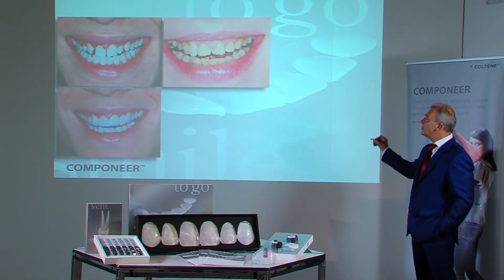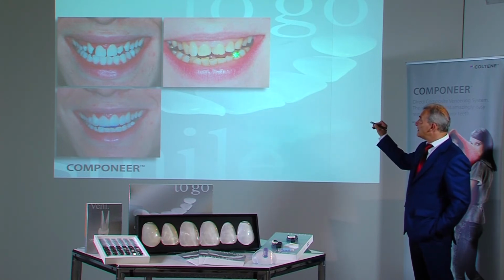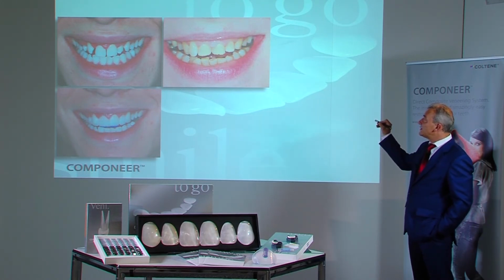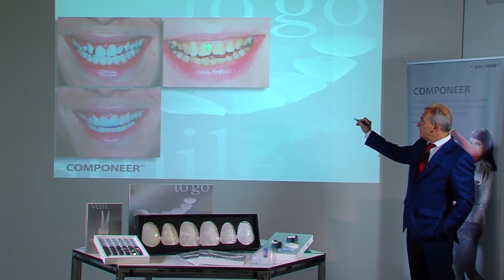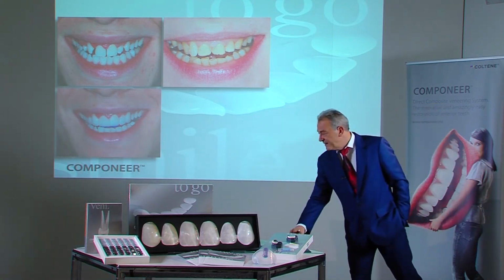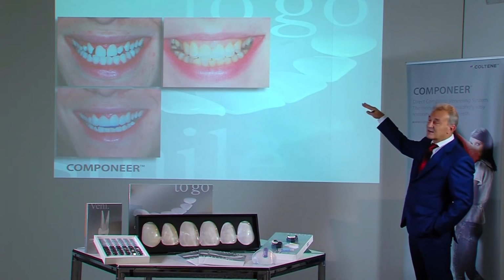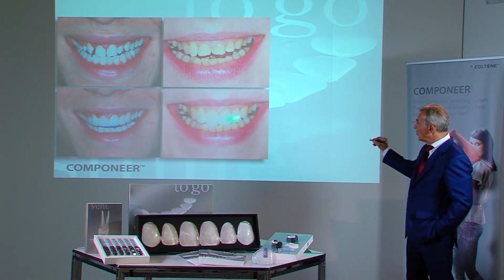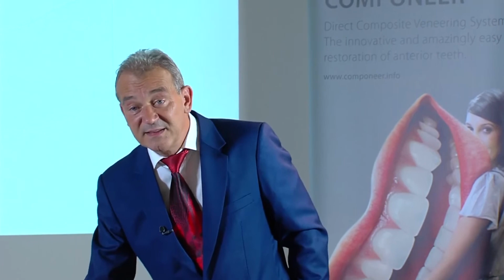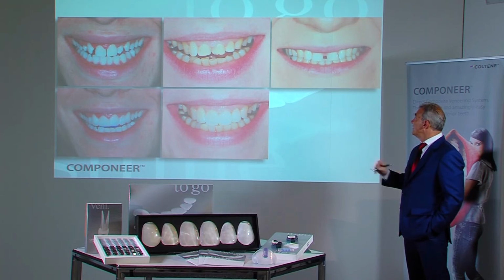It's always the same, also in this case. We see a straight upper lip and frayed front teeth. And again, we see the contrast line, which is in absolute disharmony to the upper lip. We can also see the fours, the premolars, which are somewhat inclined, as well as the two incisors at a very steep angle. Here you need to imagine an overall picture as to how this line could harmonize with the upper lip. One applies the composite and can already present the patient with a possible outcome.